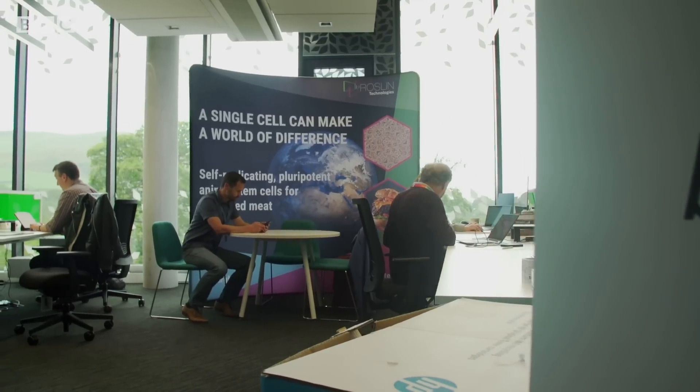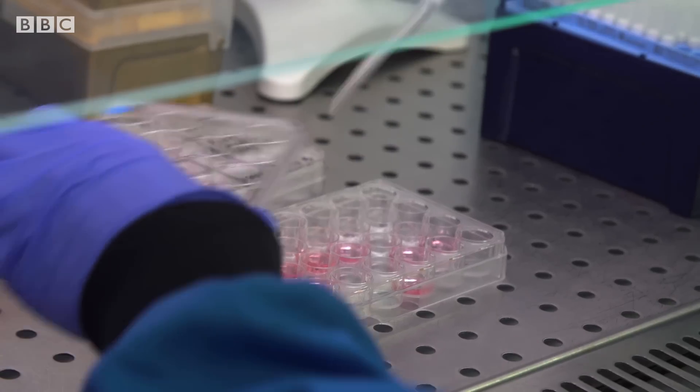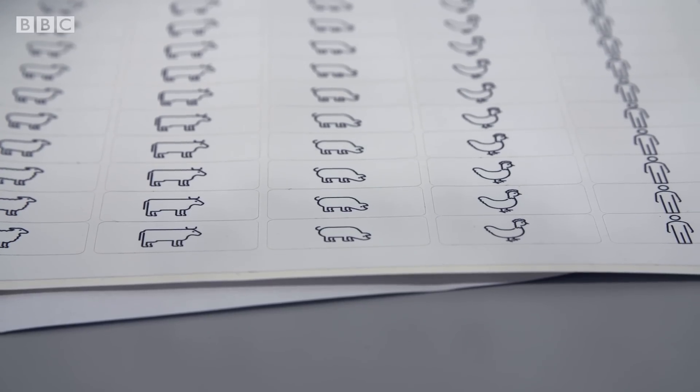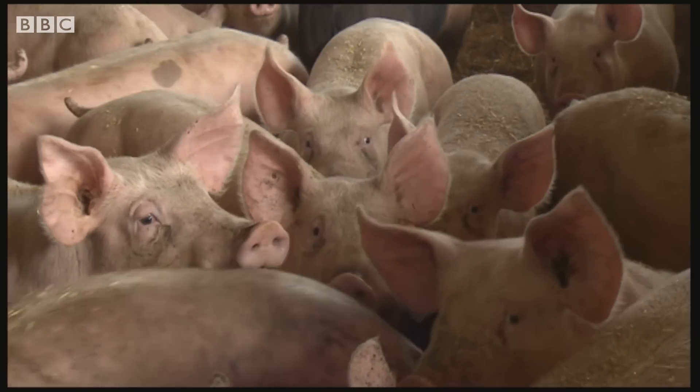Roslyn Tech are a company based just outside Edinburgh who are looking to supply starter cells to companies all over the world, who could then grow that into meat on a commercial scale. The cells come from a small biopsy from an animal, which means it doesn't need to be slaughtered, and they've then been reprogrammed.